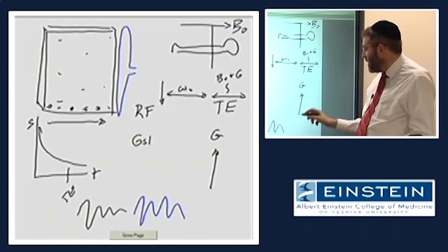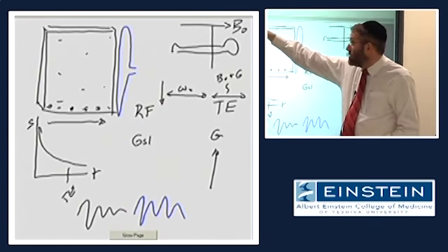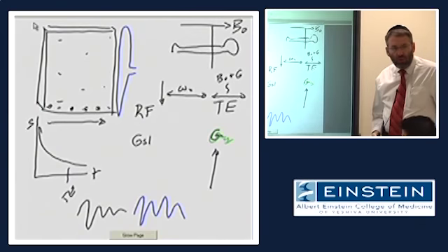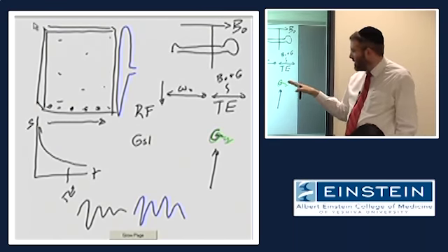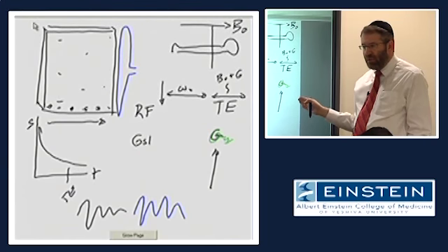So the signal that we now detect is spatially encoded based on its frequency. And in fact, we will call this the frequency encoding gradient. By having this gradient magnetic field on at the time that we sample the signal, and that's essential. It has to be on while we are sampling the signal.